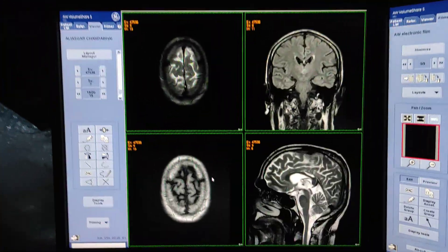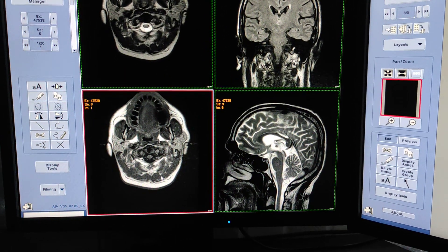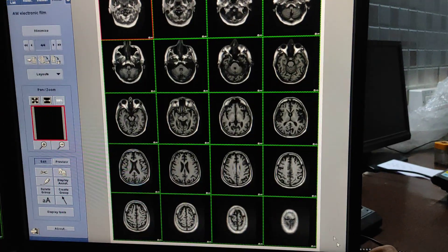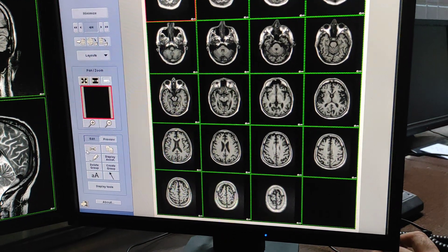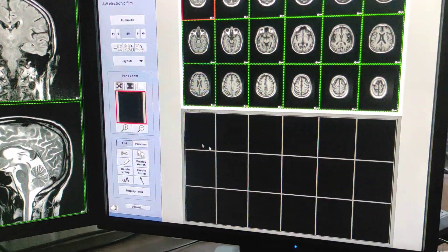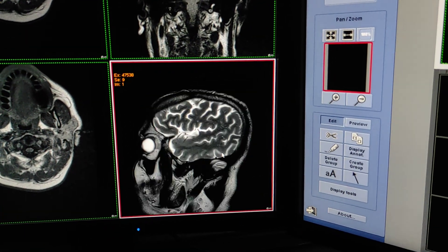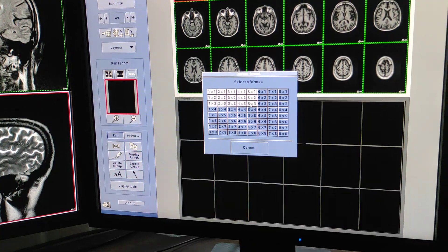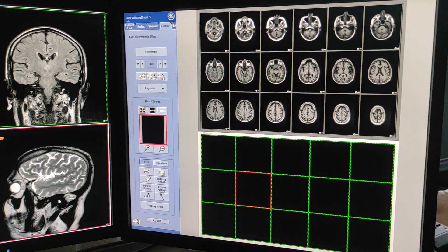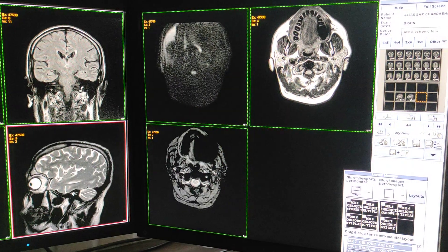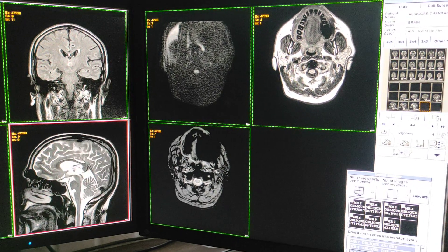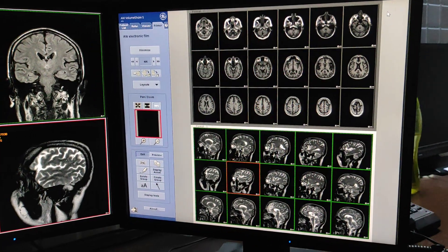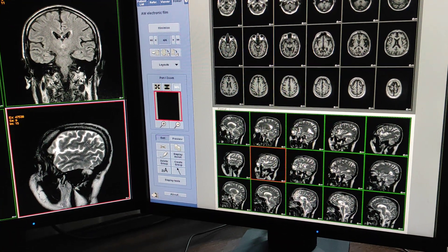T2 is a big film, coronal FLAIR is a 20-format big film, and third is diffusion with gradient multi-format. Now the same thing we have to do with T1 and T2 multi-format. Click on the box, F4, print. Cut the first image and last image, go into the layout, select the 18-18 layout. I have only 15 images for sagittal T2, so I will select a customize 5-by-3 format. With T1 I will enter 15 images of sagittal T2. Enter manually: 1, 2, 3, 4, 5, 6, 7, 8, 9, 10, 11, 12, 13, 14, 15. Now XL T1 with T2 is entered — 15 images.